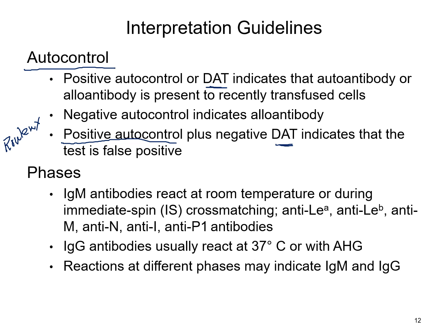Sometimes you can have some scenarios with your gel wells and those gel cards, where certain times of the year there's a lot more static activity in the air, and because of that you will have those cells draw to the sides of those plastic wells.